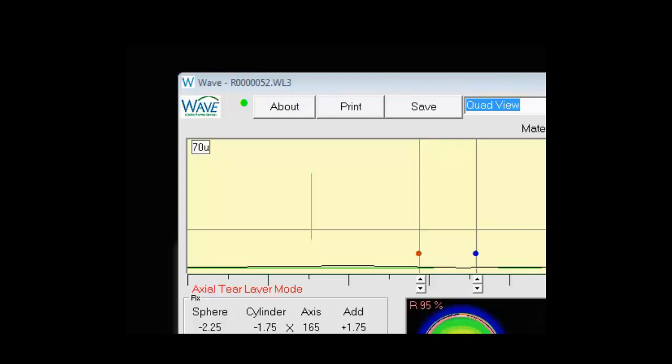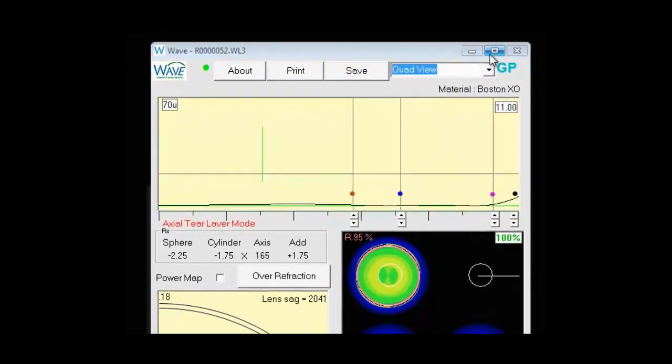As we move over, we have the minimize screen, which will minimize the WAVE display. We have the maximize, which will make it big, and this will toggle it between this larger display and the smaller WAVE display. And, of course, the X will close the program.